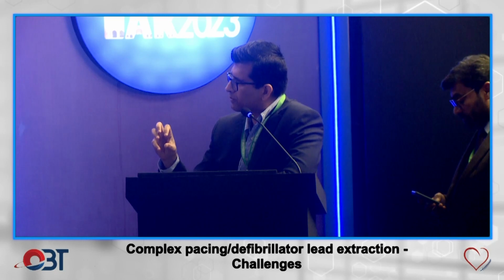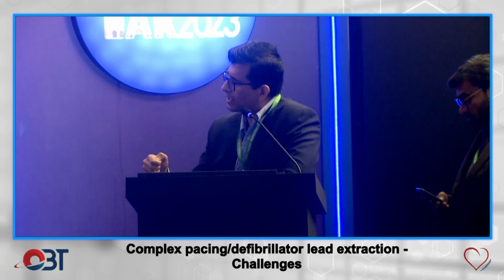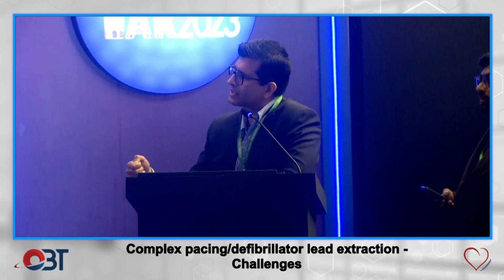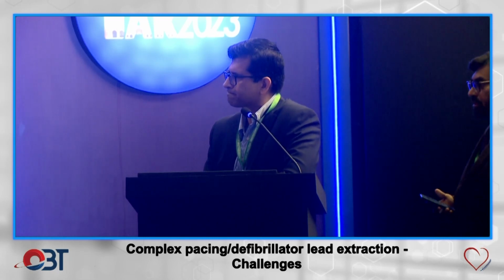It is slightly away from the tissue, it gives a pulse, and then we stop, try the outer sheath, and try to manipulate without using the laser. And if it is still not amenable to the simple sheath, that is when we orient it again and give another laser pulse.